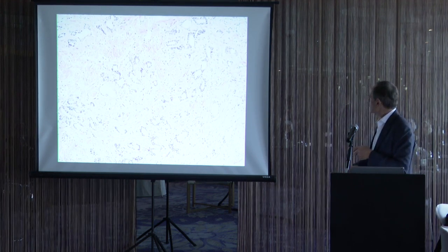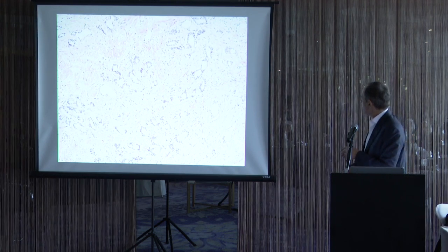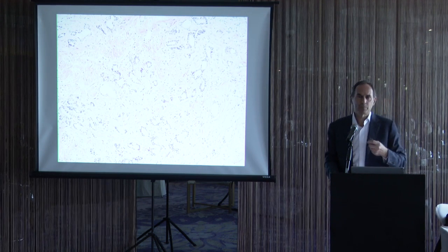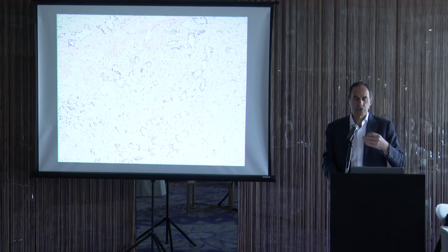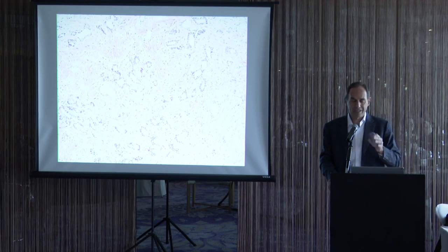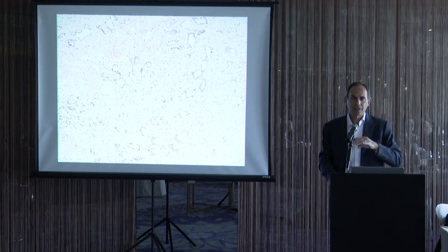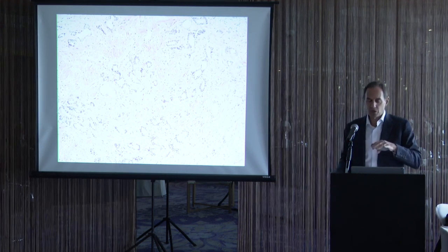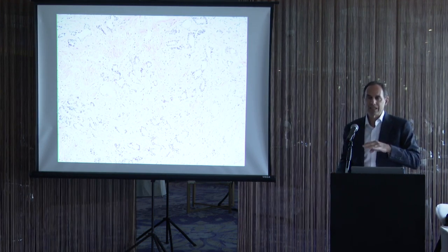And in fact, when you see this kind of sclerotic stroma around glands, that favors benign. Prostate cancer usually has no desmoplastic stromal reaction. And when it has a stromal reaction, it's a cellular stromal reaction, not this sclerotic hypocellular collagen. Hypocellular collagen around glands typically is seen with atrophy.